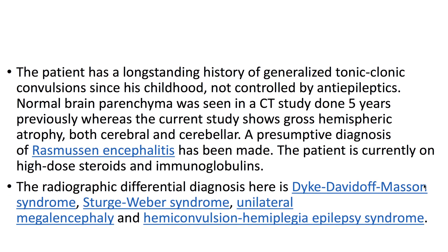The patient has a long-standing history of generalized tonic-clonic convulsions since childhood, not controlled by anti-epileptics. Normal brain parenchyma was seen in a CT study done 5 years previously, whereas the current study shows gross hemispheric atrophy, both cerebral and cerebellar. A presumptive diagnosis of Rasmussen's encephalitis has been made.